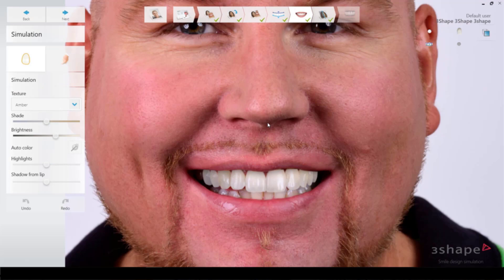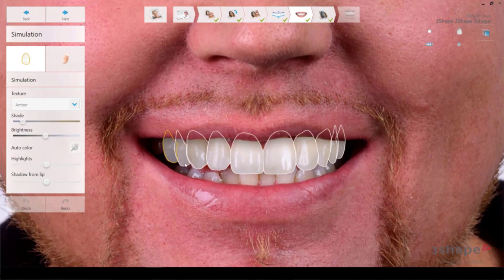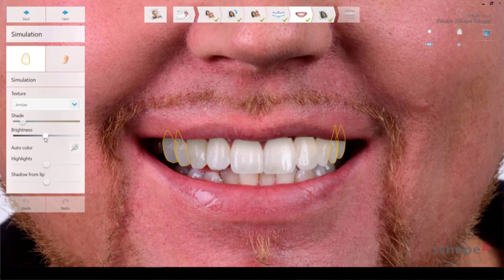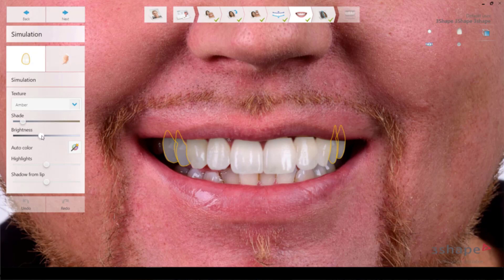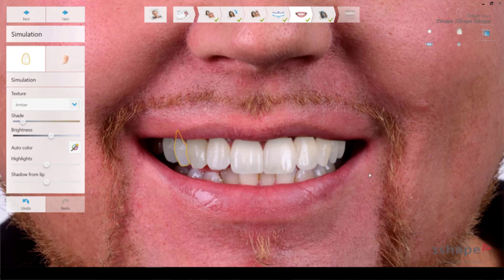Then we go to the next step where we decide the color for the patient. I normally take the premolars and make them a little bit darker — it will look even more natural. We can brighten the first premolar a little and keep the second premolar a bit darker.